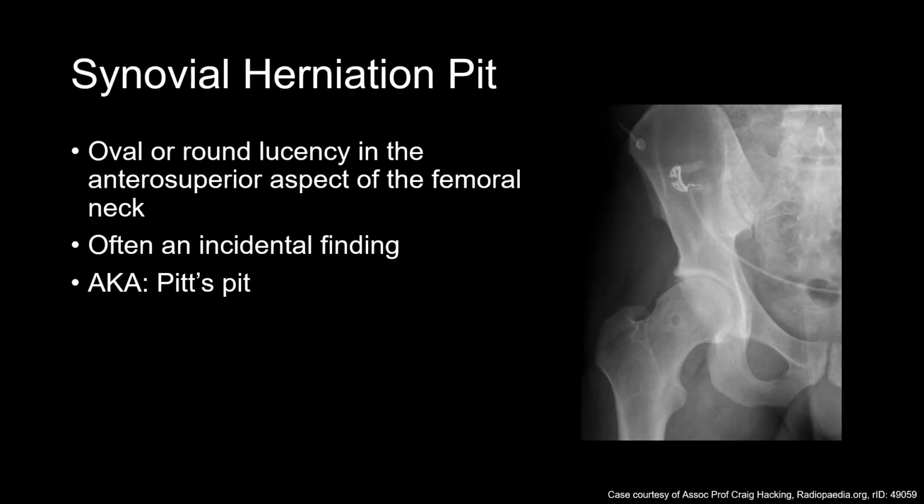A synovial herniation pit, or Pitt's pit, is an incidental finding where you have a herniation or impaction type fracture of synovial material into the femoral neck. They're usually a non-issue and you don't need to do anything about it.